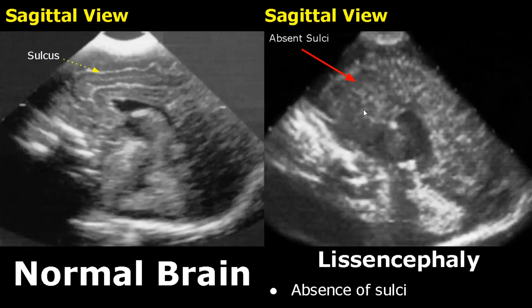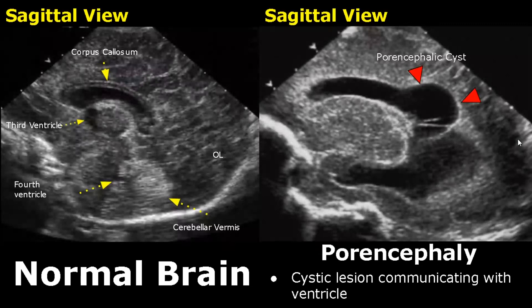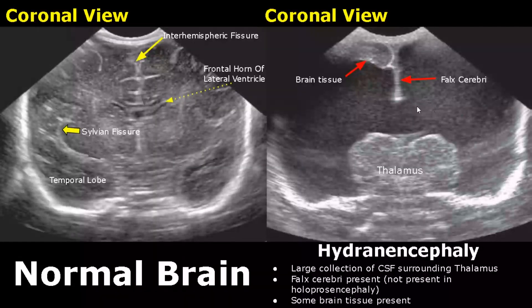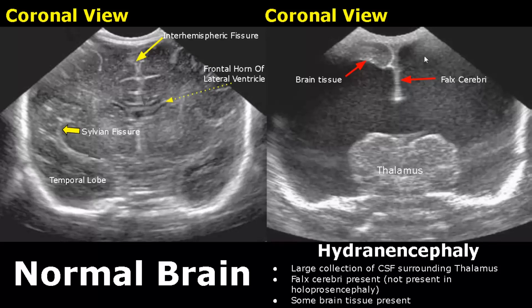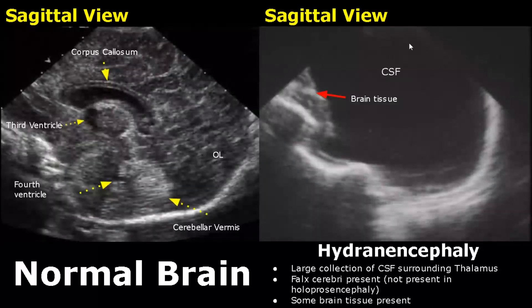In porencephaly, a cystic lesion is seen communicating with the ventricle — the cyst is connected to the ventricle. In hydranencephaly, there is a large collection of CSF surrounding the thalamus. It looks like holoprosencephaly but there is a difference: falx cerebri is present here, whereas in holoprosencephaly falx cerebri is absent. Some brain tissue is also found. This sagittal view shows hydranencephaly with a large collection of CSF and some brain tissue.